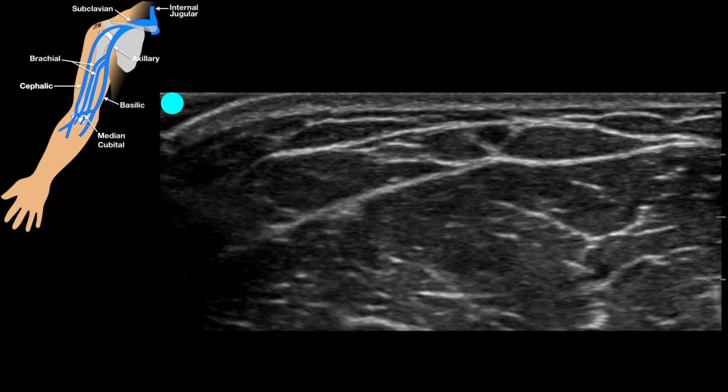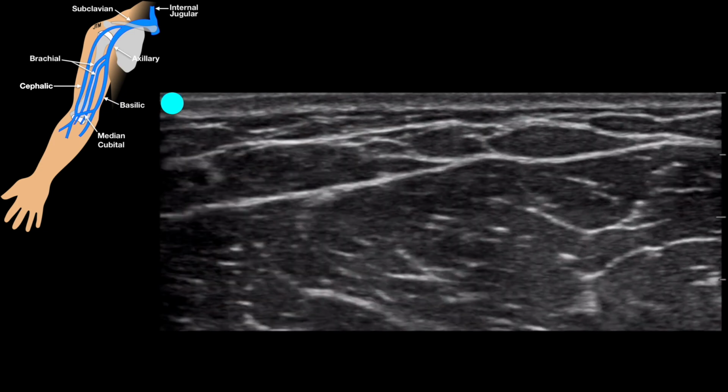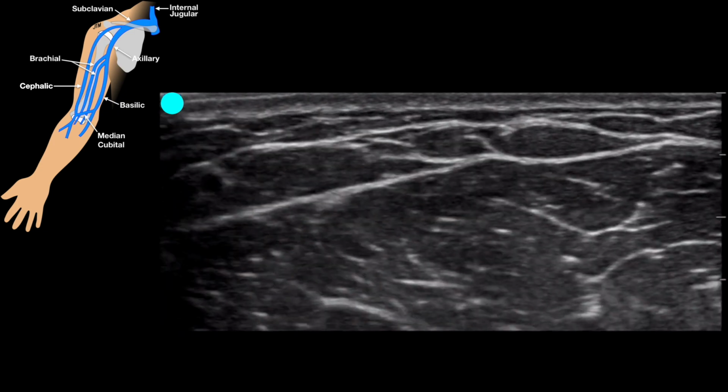So we're going to look at the cephalic vein. Now this one is not as obvious or not always there. So we can see it in some individuals. You see it a lot in weightlifters, but in the general population, when I'm looking for this, I'll still look here, but it's sometimes very hard to find simply because it's very superficial and collapsible. But we can see here that vein is very superficial, and we can just see that it's going to be a collapsible vein, and that we can tell right there that we've got a good target vessel to go for.